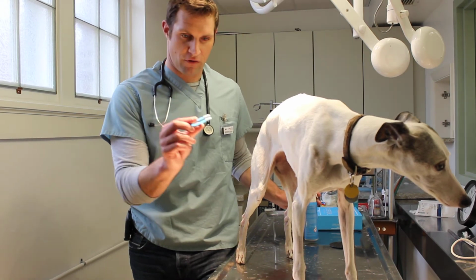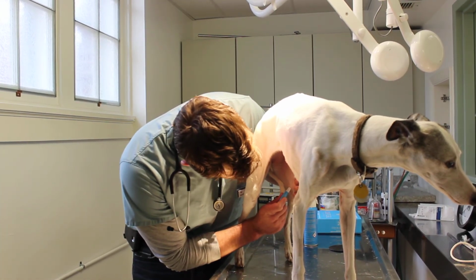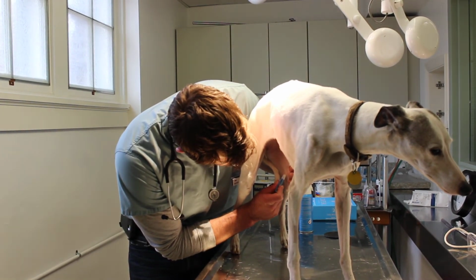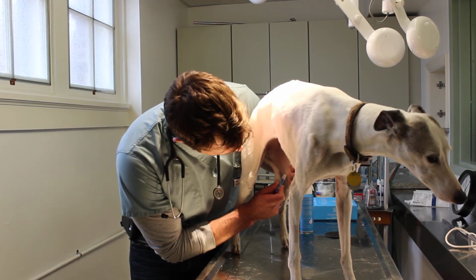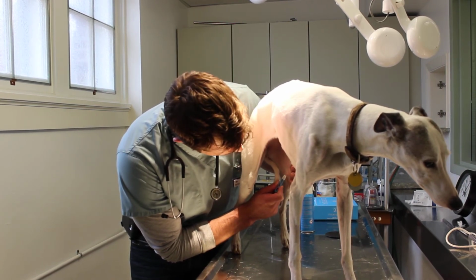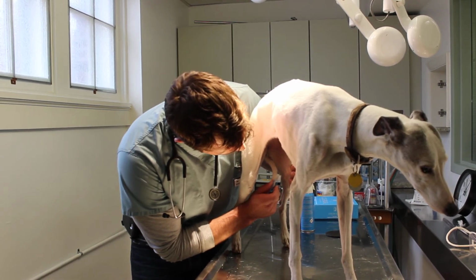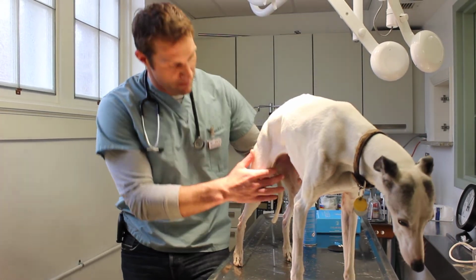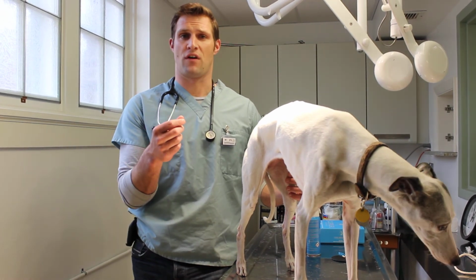And once that is frozen, you'll see that there, and I'm going to apply it for about 15 to 20 seconds on the tumor. And Bombay is not feeling any of this at all because it freezes. When it freezes itself, it actually kills the tissue off and numbs the tissue, and that's it. And we're done. And this will take maybe a week to 10 days, and there'll be a little black spot that will develop, and eventually that little tumor will just fall off.